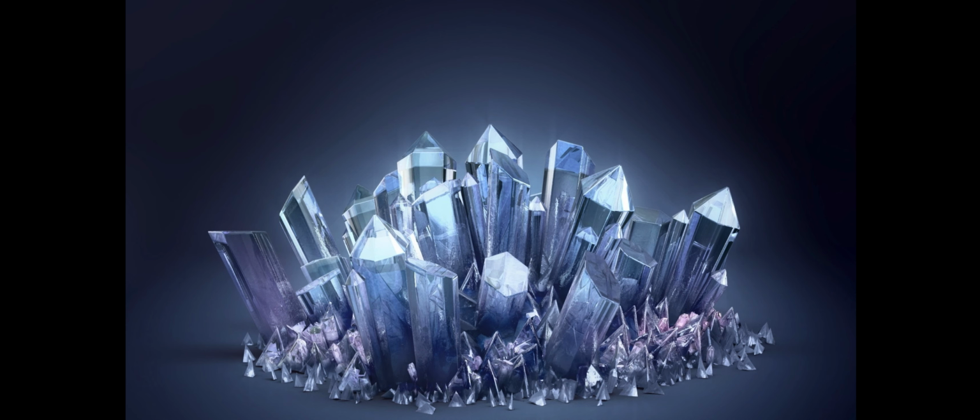Ultrasound is generated using crystals. These special piezoelectric crystals have a special property that when an electric current is placed across that crystal, it will change shape. And if we do this quickly, we can get those crystals to change shape really quickly and generate a sound wave. And if we do it quickly enough, we can generate a sound wave that is at the ultrasound wavelength. So typically many megahertz that we're going to be dealing with in the context of medical ultrasound.